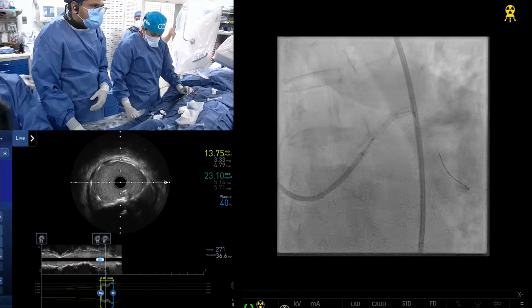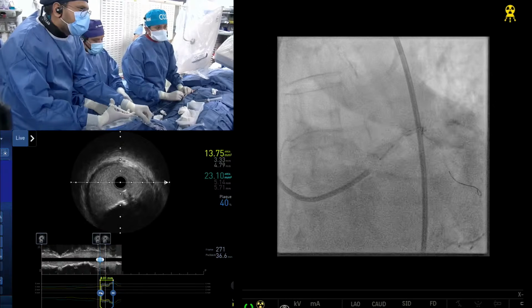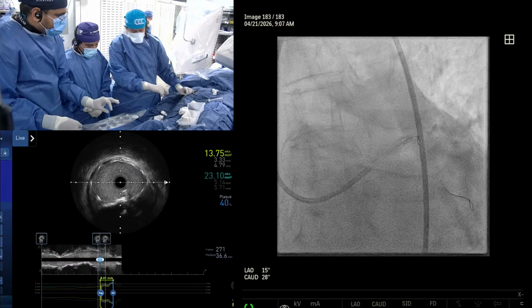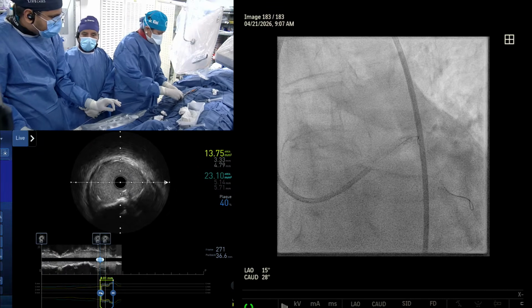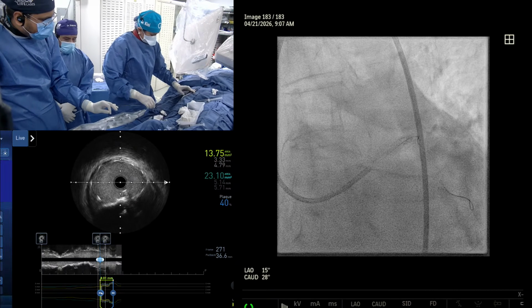I think we need 12. Some dye. Yeah, see there. Give us a 4 or 12. There's a 4.5 12. You want to go 4.5? Is there a 4.5 12? See if it's available. That's better. You don't have to push the dilator.